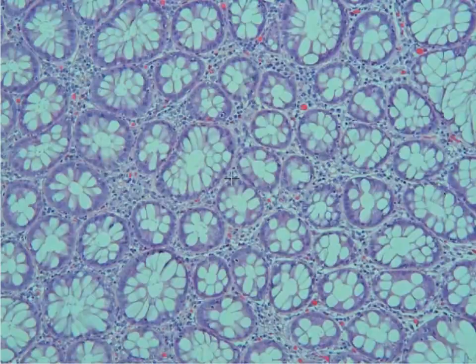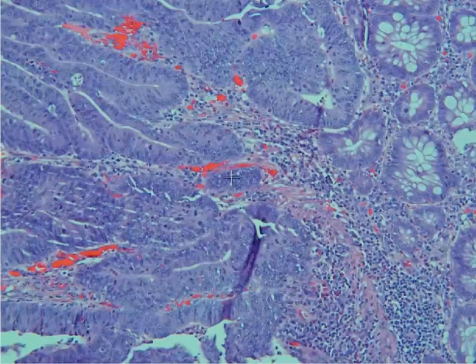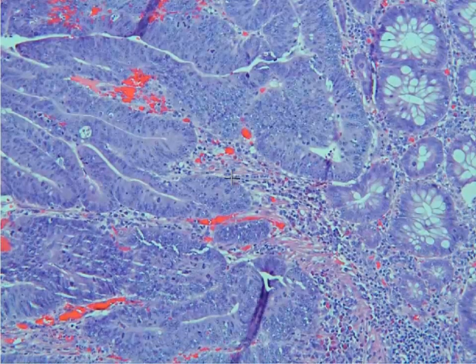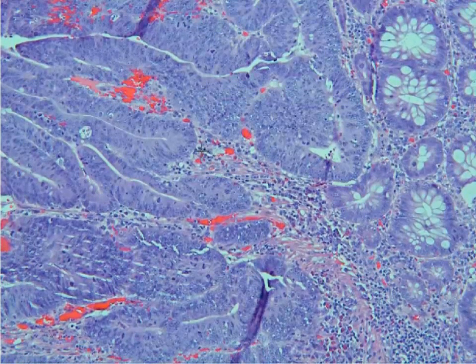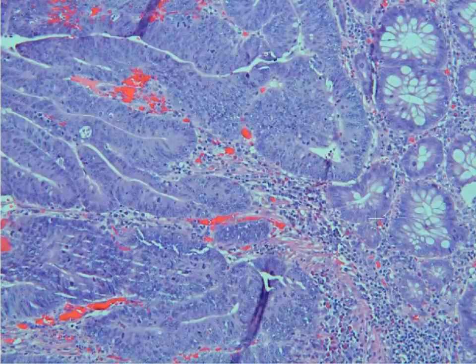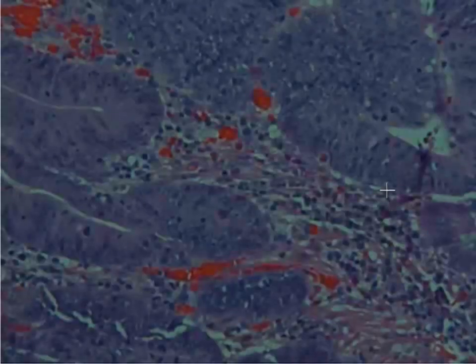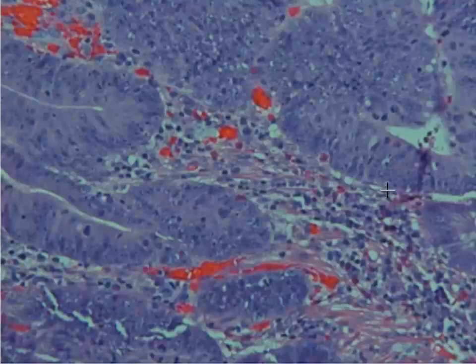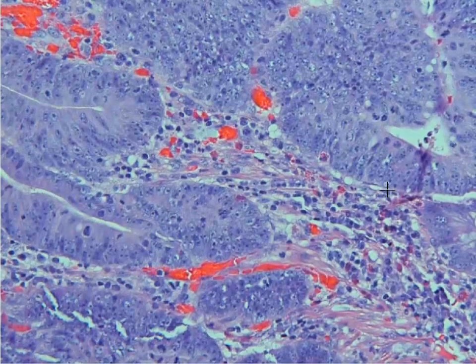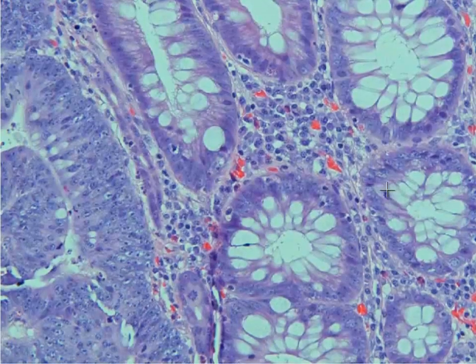Towards the edge of this is where we actually see the neoplastic colonic tissue. You can see that we no longer have the architecture we used to have with these nice rounded crypts — instead they are all distorted and falling apart.